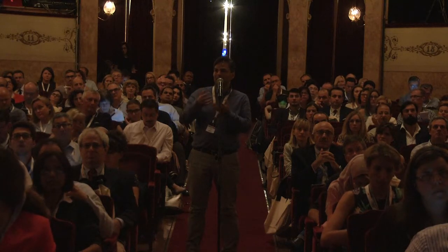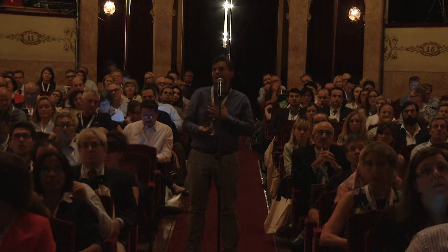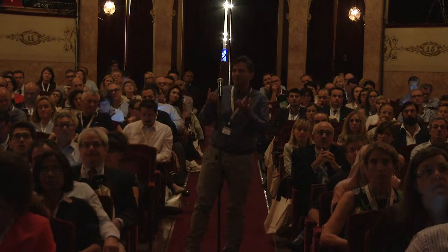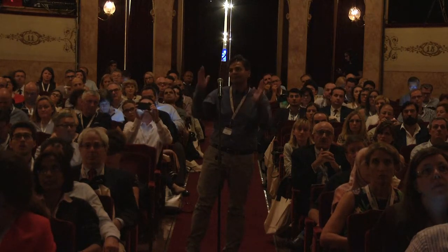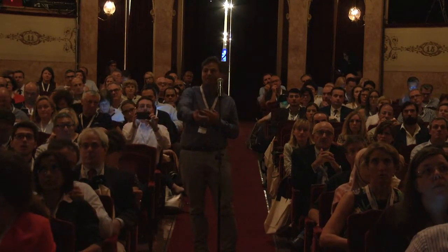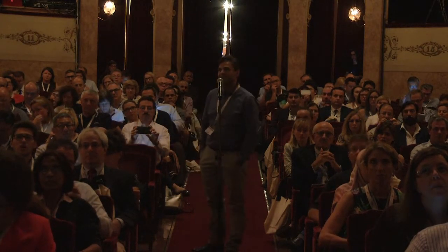But if you have differences in visual acuity, then that's a macular problem. So that's the main point: look for the signal. If the signal is okay for the media, then you have something on the retina. Okay, thank you.